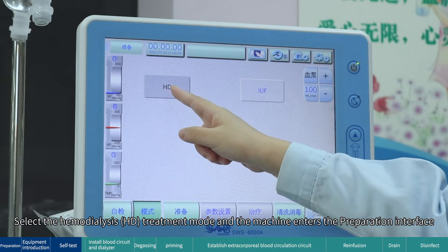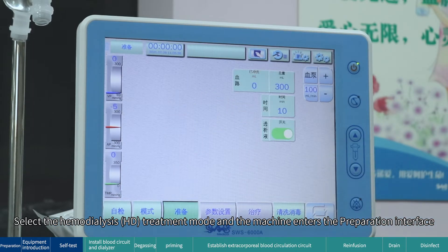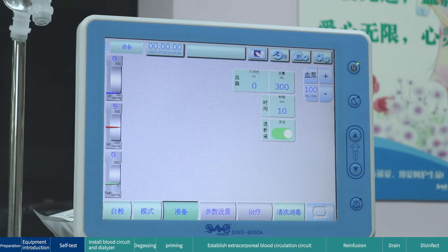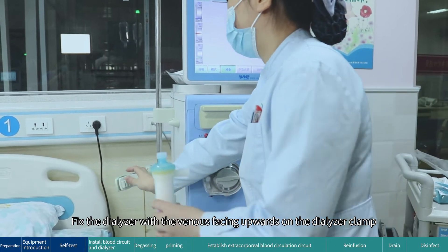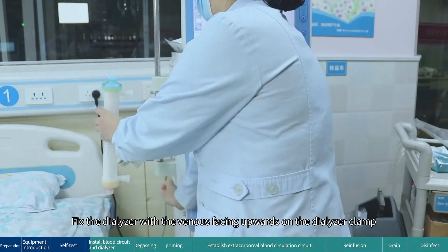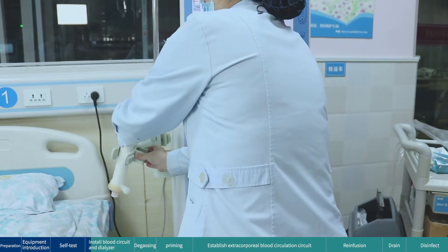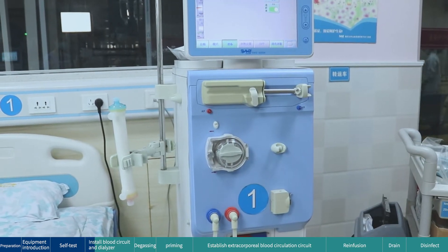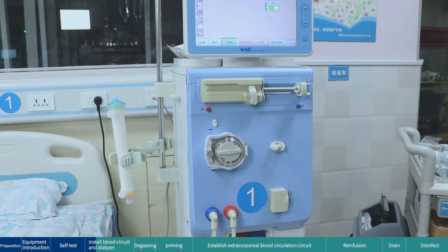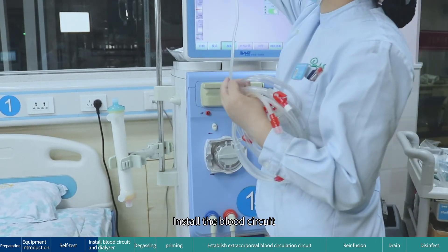Select the hemodialysis (HD) treatment mode and the machine enters the preparation interface. Install blood circuit and dialyzer: fix the dialyzer with the venous port facing upwards on the dialyzer clamp. Then install the blood circuit.